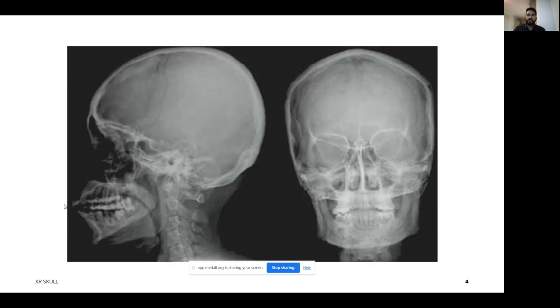Also, if you look closely, covering the brain, there is a bit of CSF lining there. CSF and brain tissue are very similar in density, so it's difficult for us to differentiate the brain from the CSF as well. So even if we try different views, we are not getting a good view of the brain. And this started making healthcare professionals and scientists in olden days start thinking, how can we see the brain? What can we do to visualize the brain inside the skull?